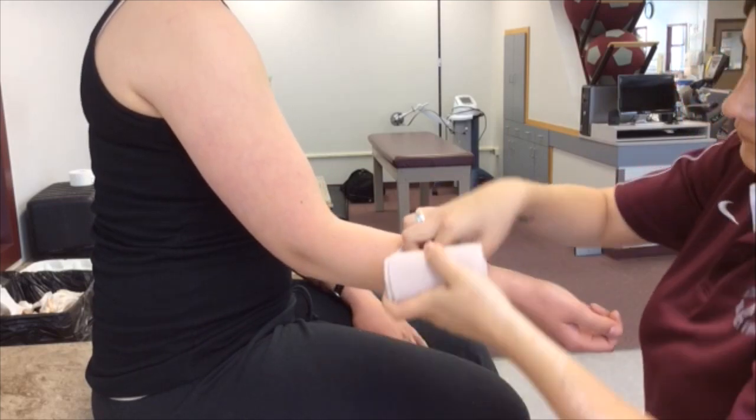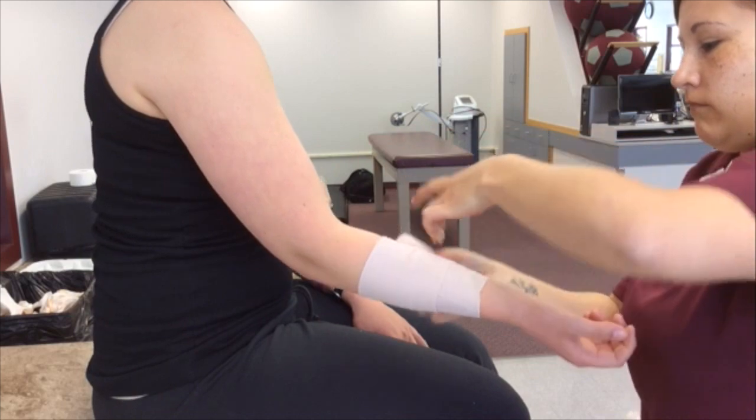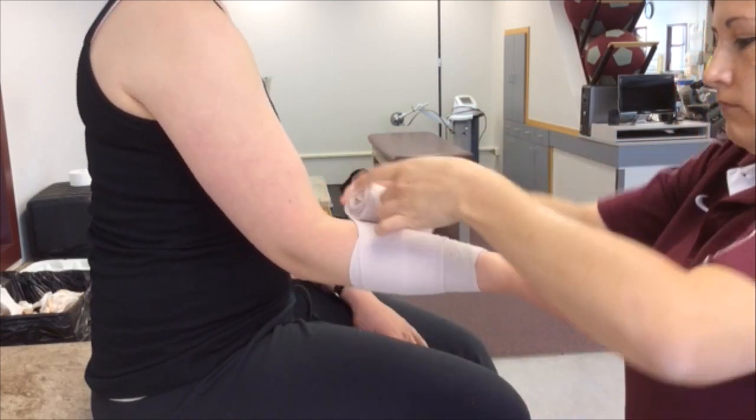Have the patient slightly flex the elbow. Use a 4 inch double ace wrap and apply at the distal end of the forearm.